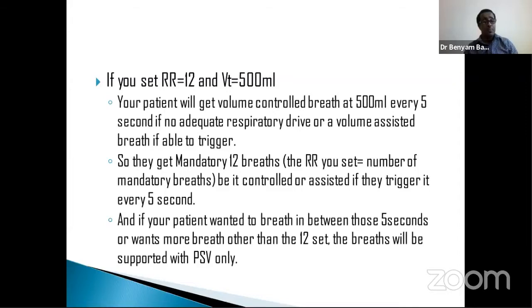Then the breaths will be supported. If you remember earlier, when we're using assisted control, if a patient is able to initiate breaths greater than the set respiratory rate, they will be assisted via volume or pressure. But in this case, there wouldn't be any assist. The only thing the patient will have is the pressure support that we set. So we call this spontaneous breathing, and spontaneous breathing will be supported with pressure.